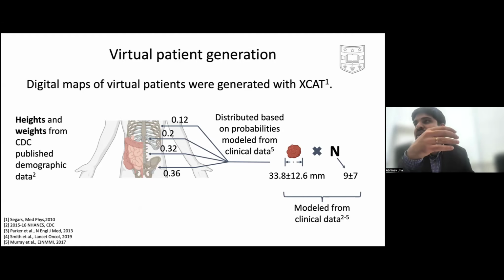With alphas, even single time point dosimetry may be enough in some locations, in some cases. Our job would be a bit tougher simply because there's probably more literature out there for how much counts there are in tumors versus the pharmacokinetic parameters. Yes. We're trying to look for these numbers.